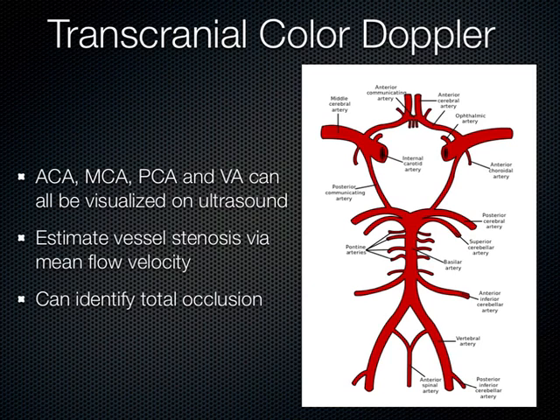And when there's a block, or a narrowing of the artery or stenosis, we see the flow velocities really jump up using the Doppler. We can measure the velocities, and we see the mean flow velocity really jump through the ceiling when there's stenosis. So that's kind of what you're looking for. And you can also identify where there's been a total occlusion.